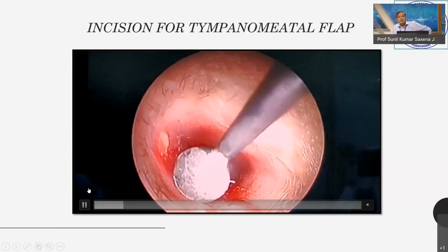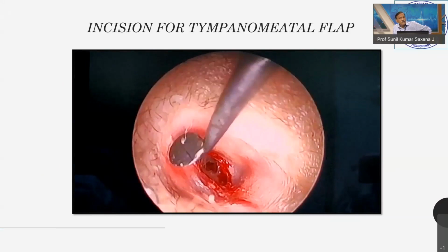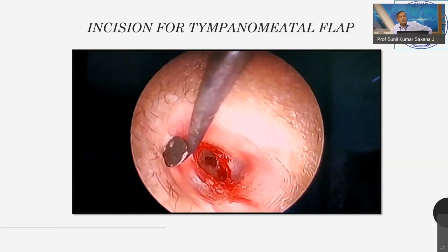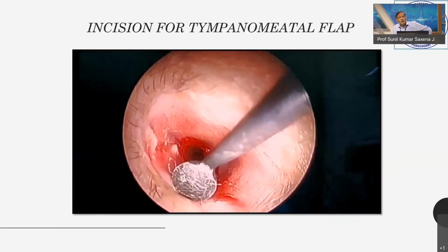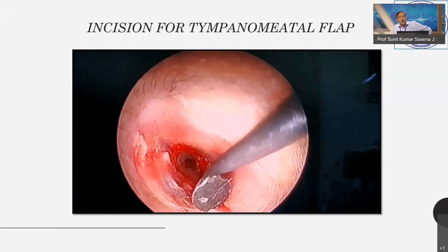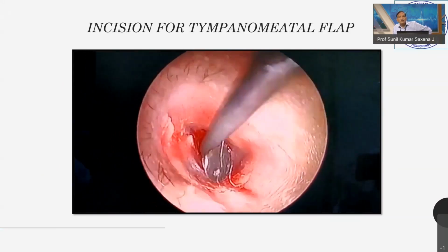So I went to the annulus, then start from the superior area, which is the thick skin, press it hard once or twice. That crushes the capillary, that decreases the vascularity. Pressing hard over the bone, keep on going downwards, 12 o'clock to 6 o'clock. Once you start seeing whitish bone, then your elevation will start.